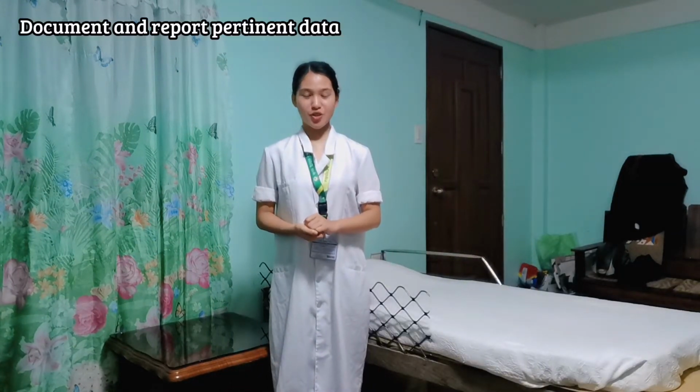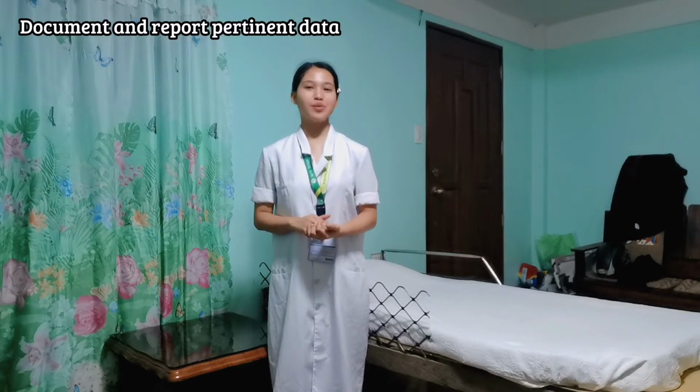And for the last procedure, we are going to document and report the pertinent data.